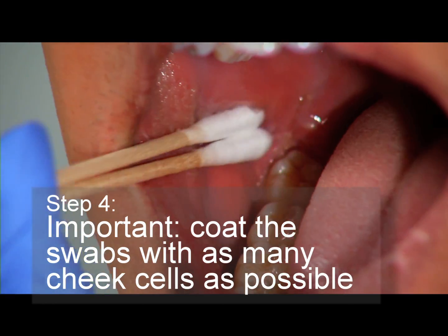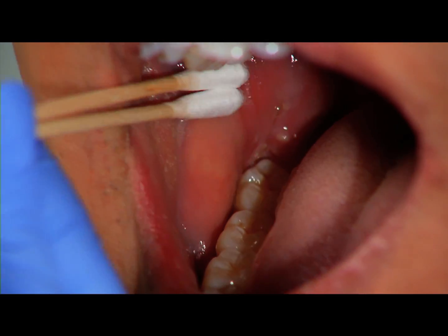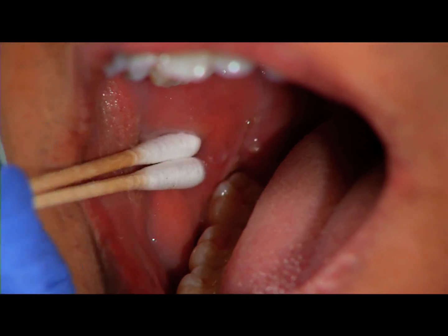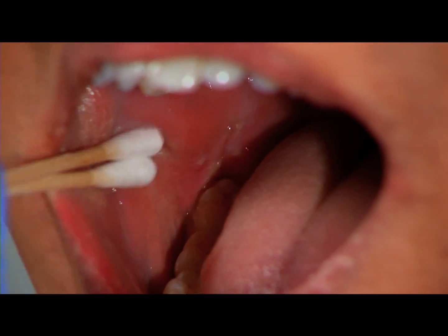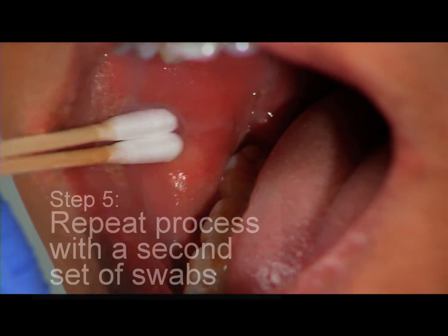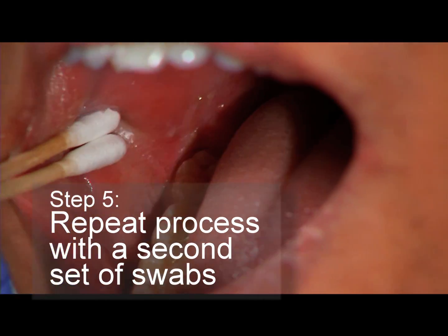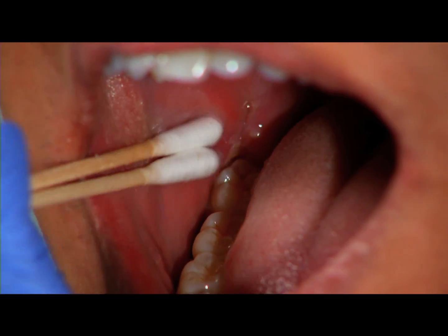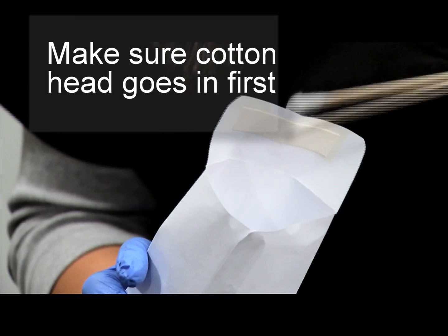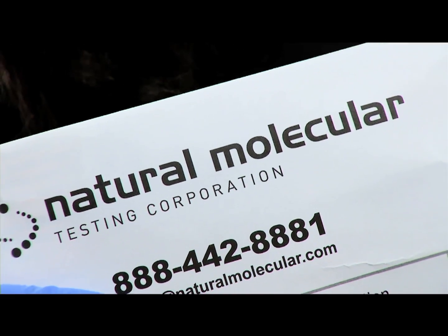Step 4: begin swabbing. It's important to coat the swabs with as many cheek cells as possible with these easy-to-do techniques. Place the swabs against the cheek and apply gentle pressure, rotate up and down, back and forth, cover as much surface area as possible for at least 10 seconds. Repeat this process inside the same cheek with a second set of swabs. Let the swabs dry before placing them into the envelope, making sure the cotton head goes in first.